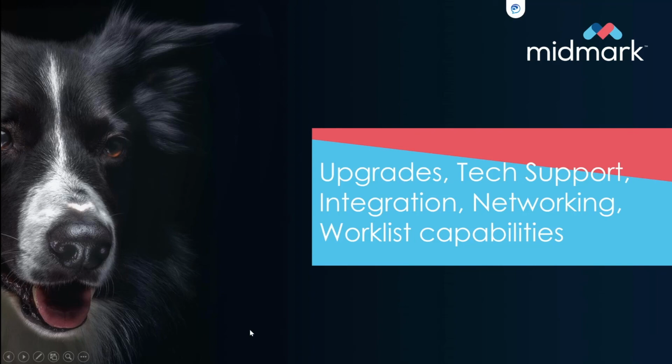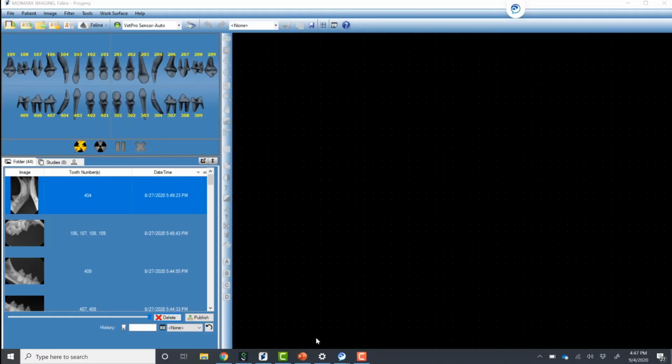Lastly, with the tutorial, I would like to go over a few important things: upgrades, tech support, integration with practice management software, networking, and Worklist capabilities. We'll begin with how to get your upgrades. As an owner of Midmark Imaging Software and sensor system, you have unlimited upgrades for the life of your sensor.